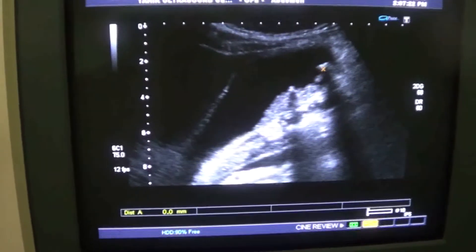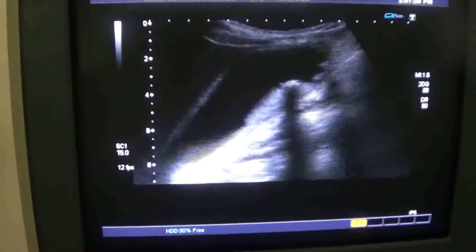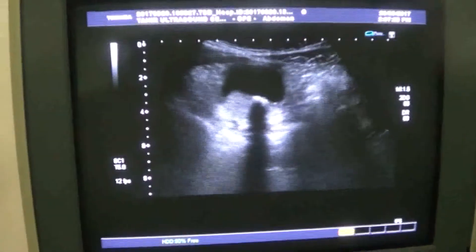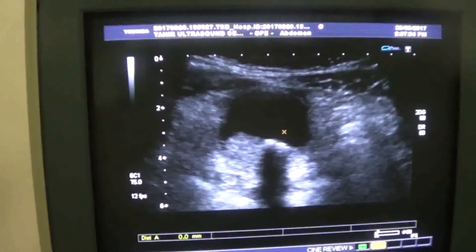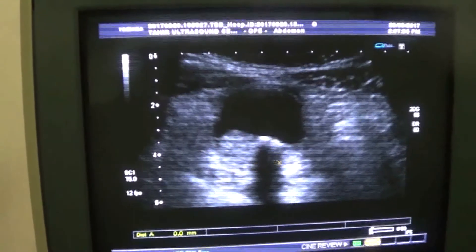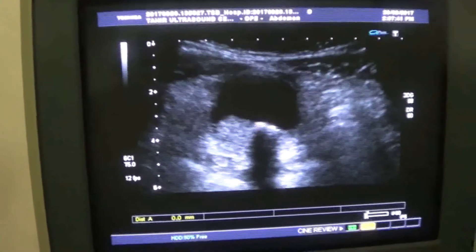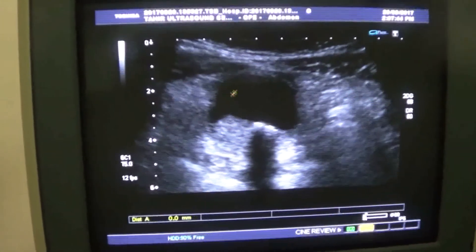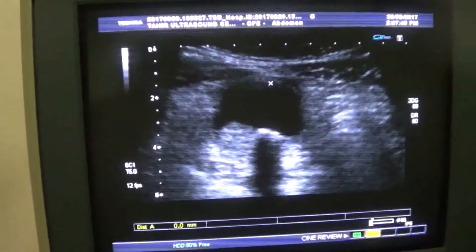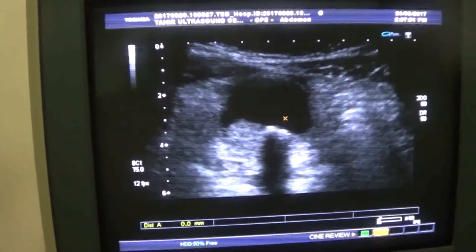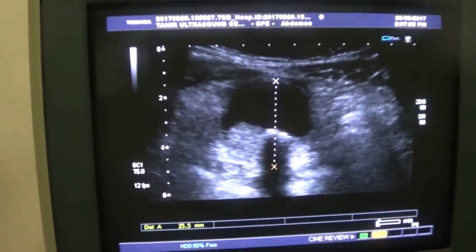Tiny calculi — one, two, and three — are seen suspended. This is the transverse section of the gallbladder where you can see layered-out sludge, and anteriorly two calculi giving posterior shadow. The gallbladder is not extended, as the transverse section measures 3.5 centimeters.